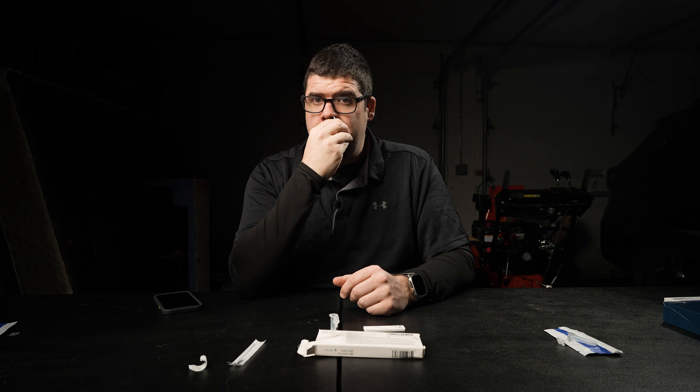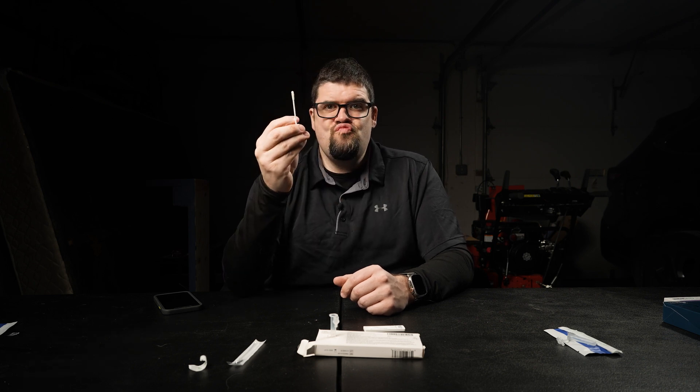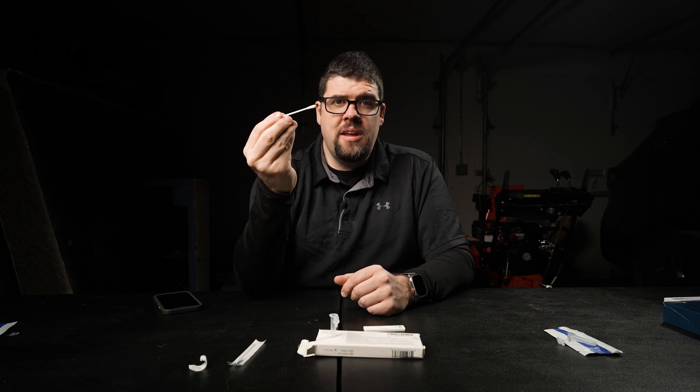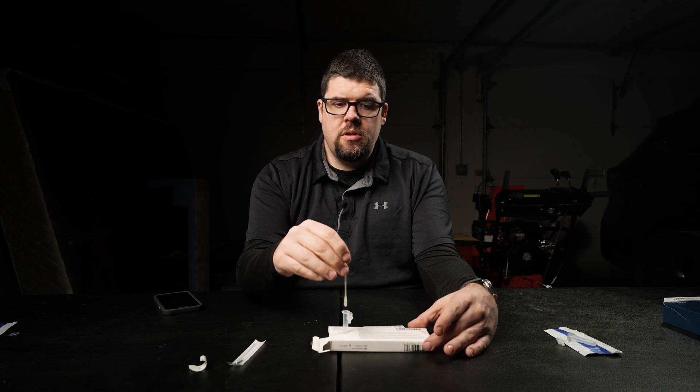Now performing the swab in both nostrils. We're going to go to the other nose now. We're golden. I'm going to take my swab and put it into the liquid solution.